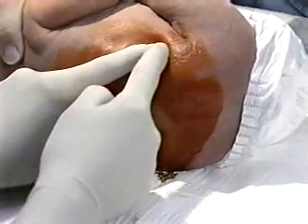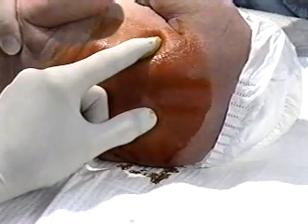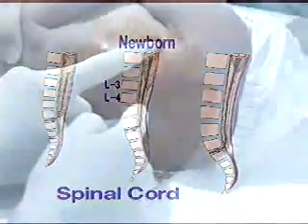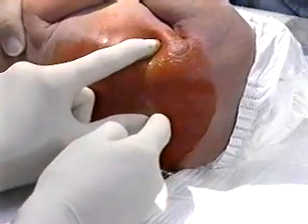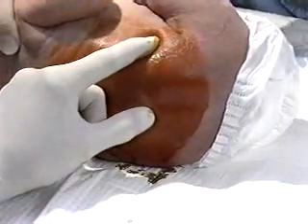An imaginary perpendicular line is drawn straight down from the iliac crest to the spine, and the vertebral interspace is felt at that point with the thumb of the same hand. This space corresponds to the L3-L4 vertebral interspace level. The practitioner will then move one space down to the L4-L5 interspace for the first puncture.